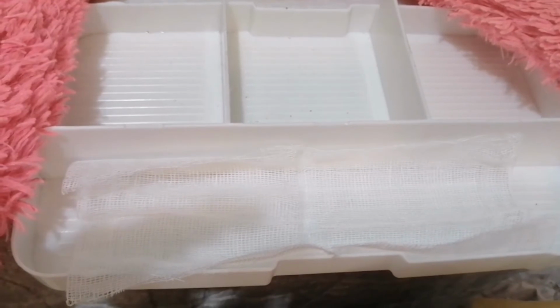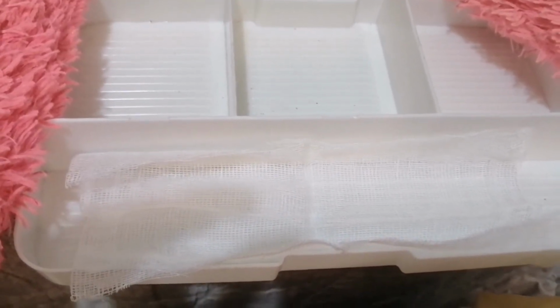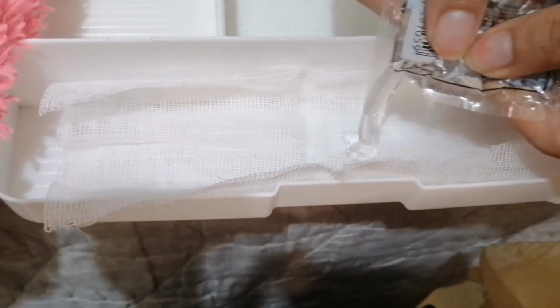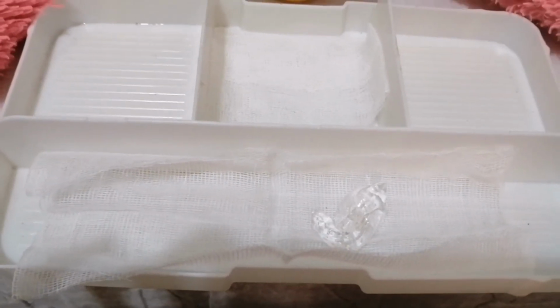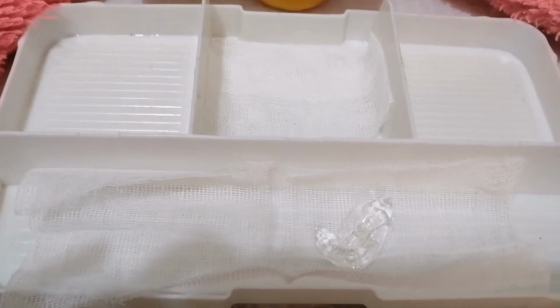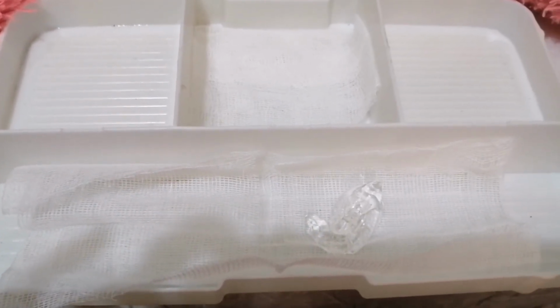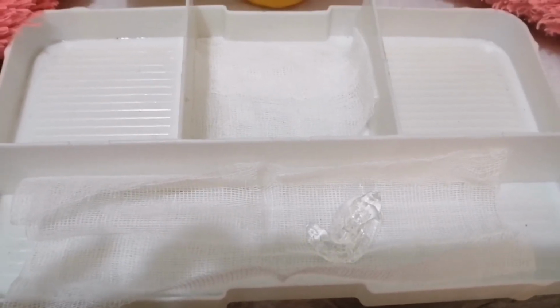Squeeze a small amount of lubricant over the sterile gauze placed in the sterile field. Organization promotes efficient time management. Using sterile pickup forceps, get 2 cotton balls with betadine antiseptic solution from the sterile jar and place them on the sterile field on top of the gauze. Open the wrapper or plastic cover of the sterile specimen bottle and drop it on the sterile field.